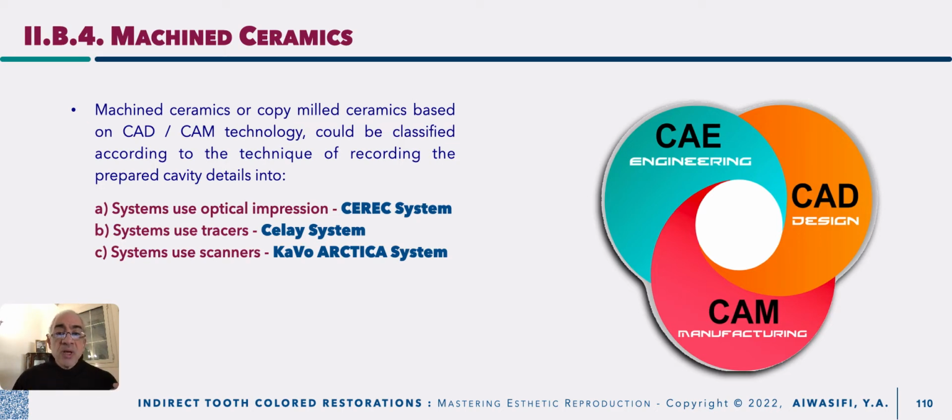That's why we classified our system according to the technique they transmit the picture of cavity details into the system, or to the milling machine directly into three types. Either we transmitted it with optical impression, then we have a camera, and as example for this, the most popular and most common system is CEREC system, and it is the first and oldest system in CADCAM technologies in dentistry.